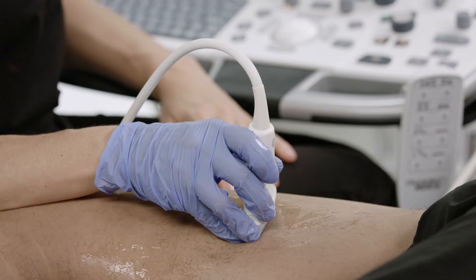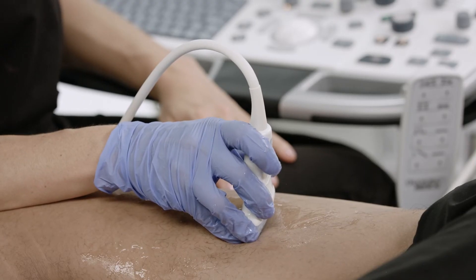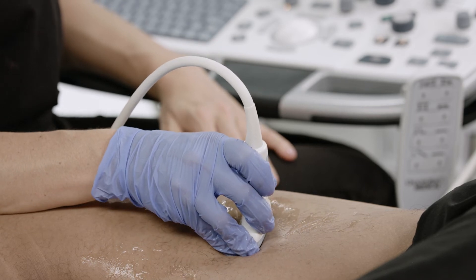However, when scanning patients with difficult body habits, increased transducer pressure is necessary to image the target vessel.